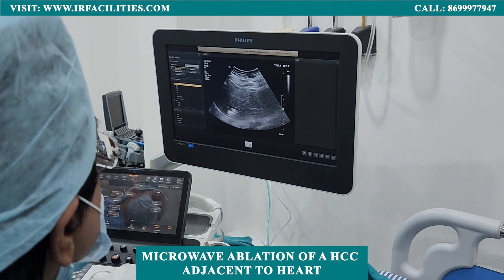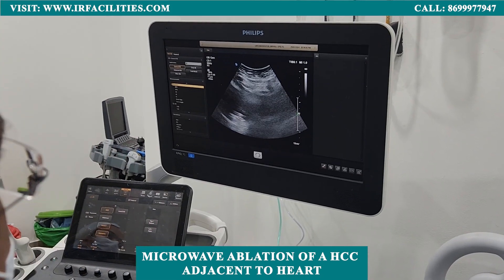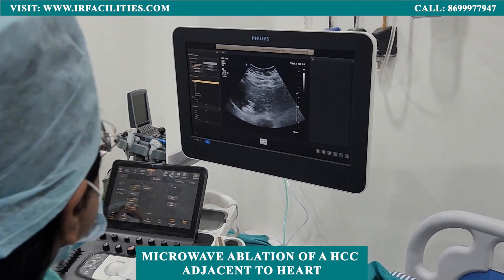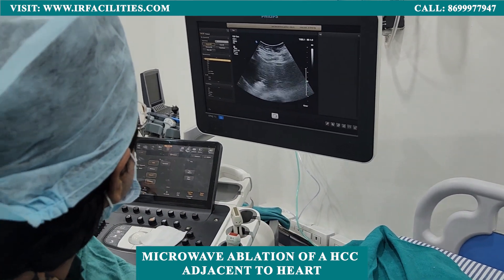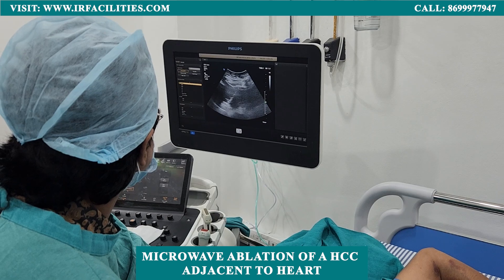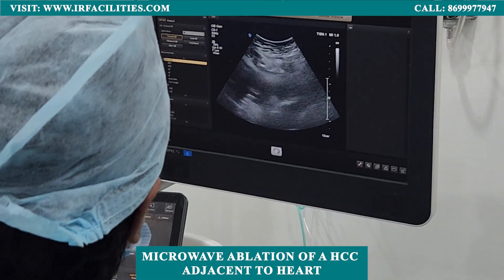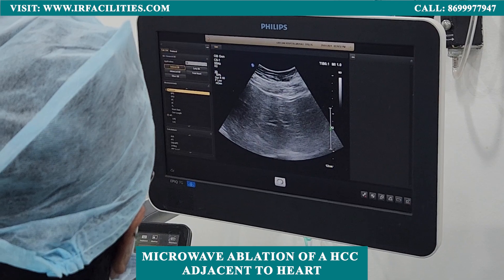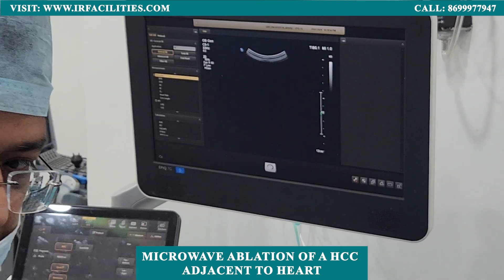So then we will see the fumes. Do you see the fumes immediately? Yes. Do you see the fumes immediately? Do you see? Instantly. Do you see the fumes immediately? Yes. So that's the fumes. We are going to ablate it. Now for 15.